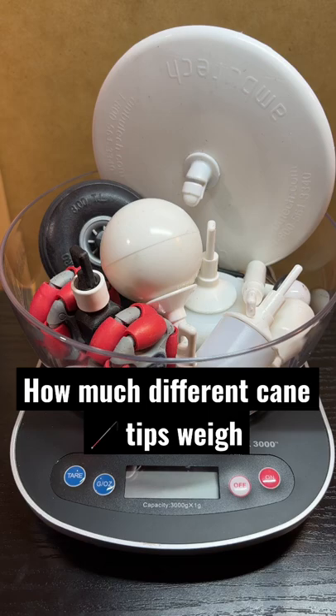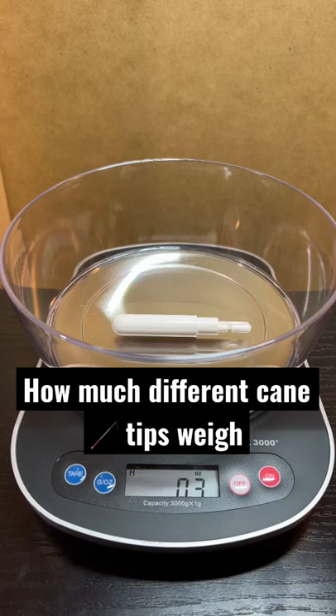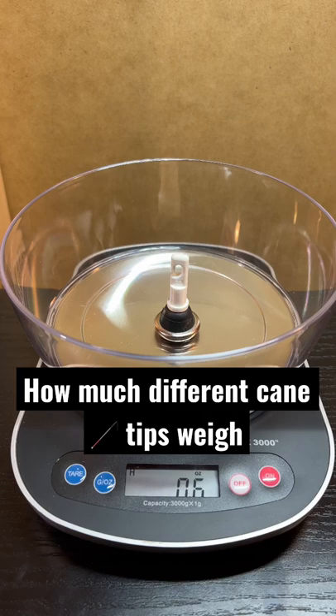This is a pencil cane tip, 0.3 oz. This one is a metal glide tip, 0.6 oz. This is a ceramic cane tip, 0.5 oz.